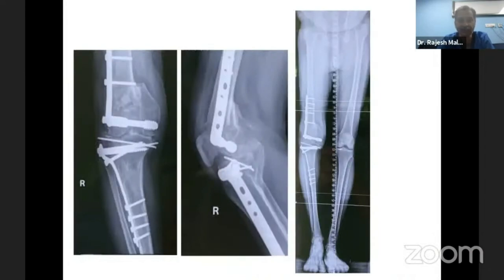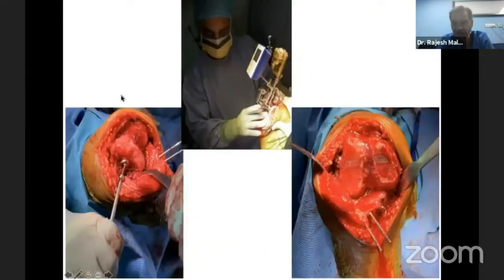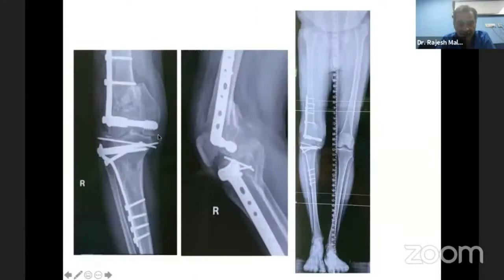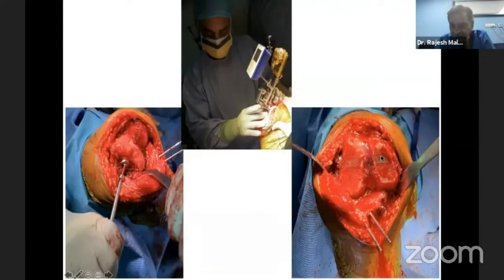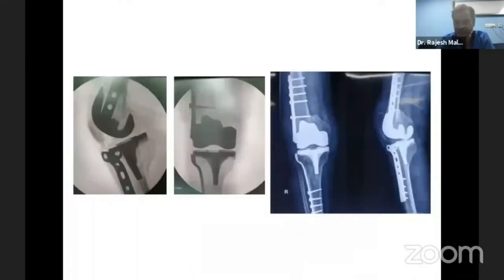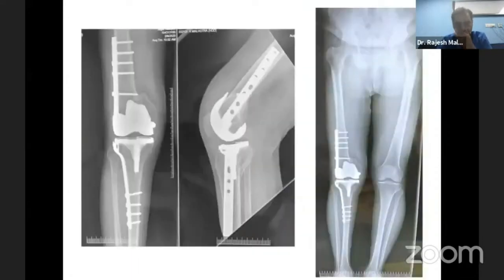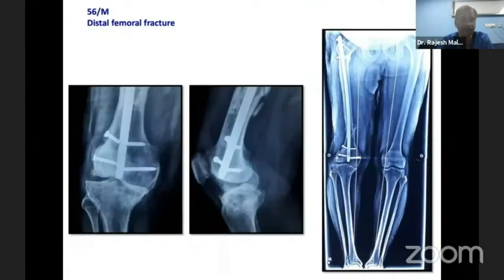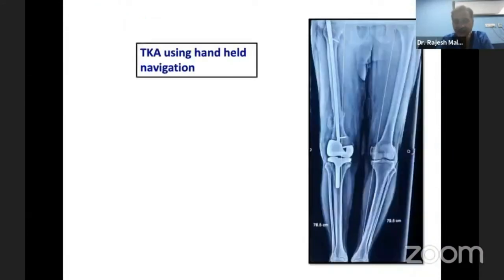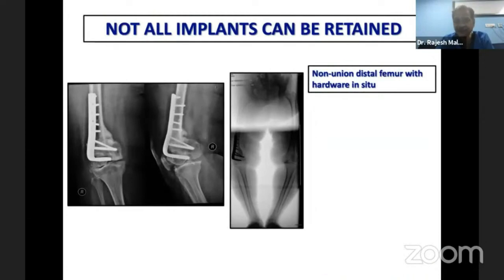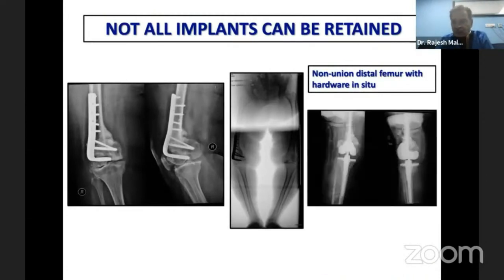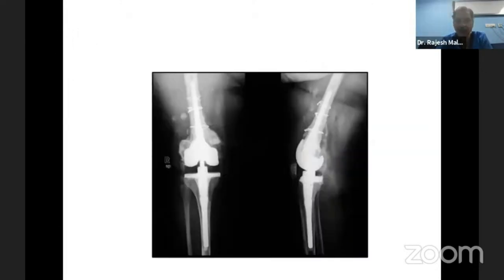Another case had a severe fracture that was fortunately united. I could see approximately nine millimeters of bone, so I didn't think the hardware would come in the way. On the distal femoral cut you can just see the threads of the dynamic hip screw. Using handheld navigation, good alignment was achieved in about 45 minutes without making the surgery overly complicated. In a 56-year-old male with a distal femoral fracture that was nailed, the nail could not be removed. I used handheld navigation and performed the replacement without removing the nail. Not all implants can be retained — in a distal femoral non-union with hardware in situ, everything must be removed and a hinge implant may be needed.